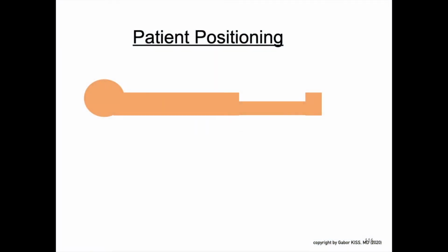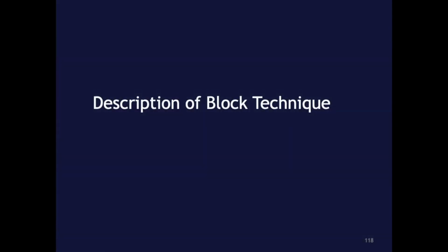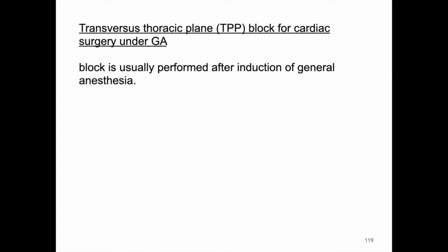Patients can be positioned either supine or, when the block is done awake, with their head up to aid with respiratory status if needed. Description of block technique. In cardiac surgery, the block is usually performed after induction of general anesthesia.